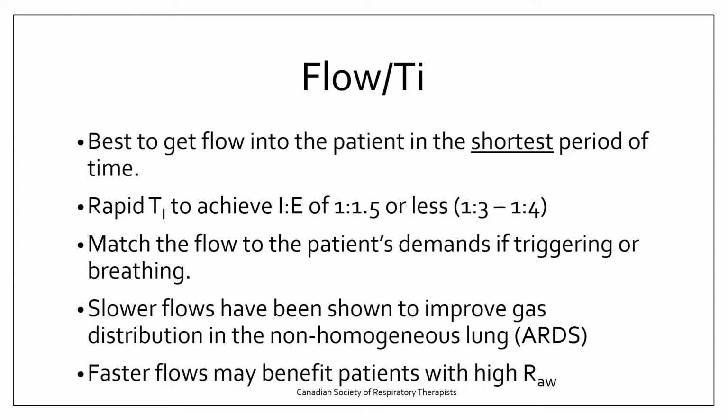When we're looking at flow or I time, they're very much related to one another. In some ventilators and in some modes of ventilation, you're going to set flow, and in others, you're going to set I time. And really the goal is to get the flow into the patient in the shortest period of time possible.